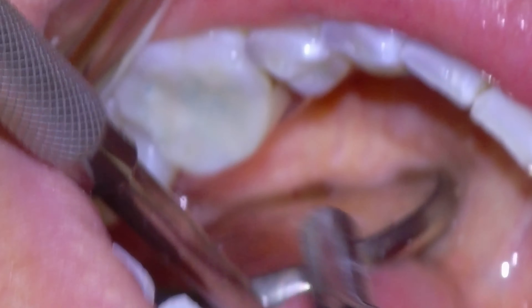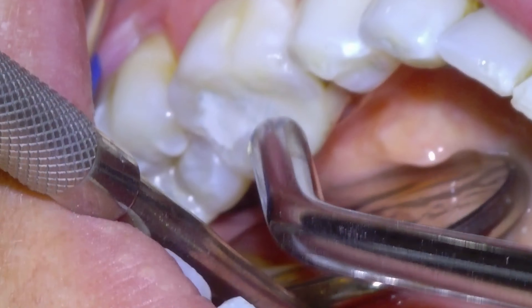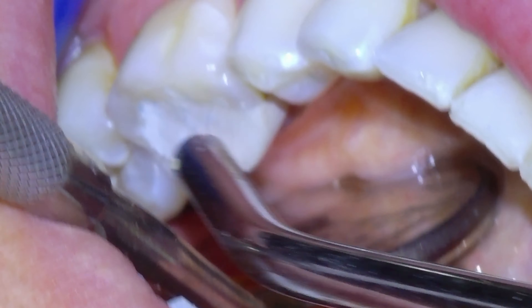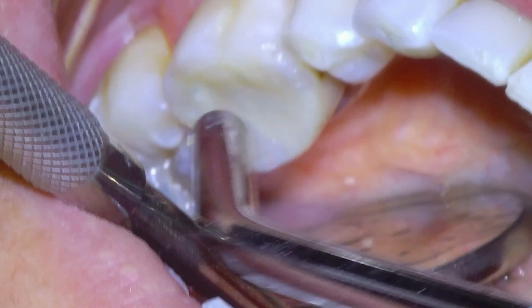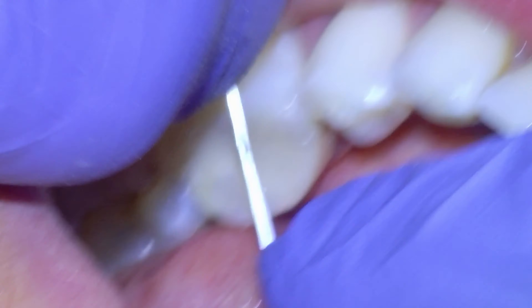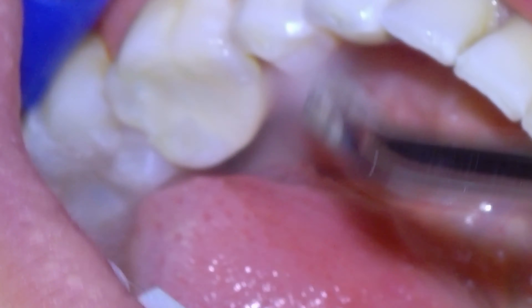We're pretty much ready to seal it up. We're going to wipe off the dye with my thumb, then dry the filling material before applying our varnish, which just coats the surface and makes it smooth to the tongue. That gets air-thinned and then light-cured. Check with some floss to make sure you can still get in between there — and that's pretty much finished. This one's going to do well.